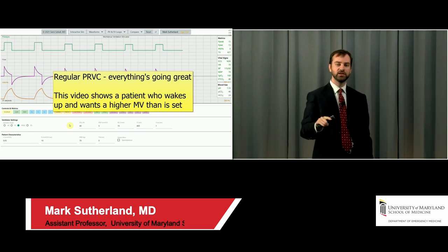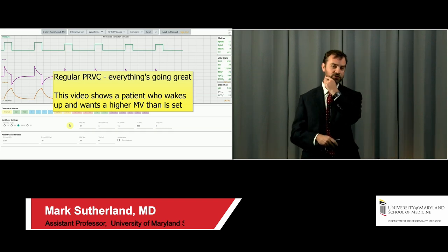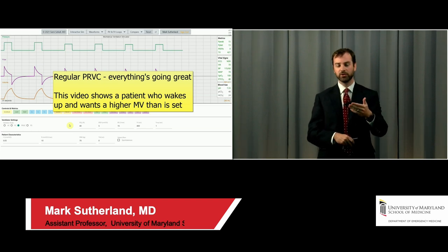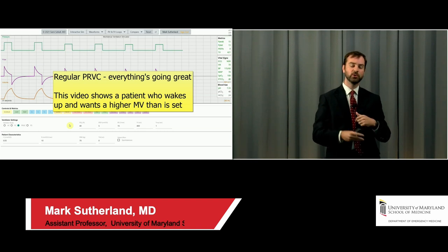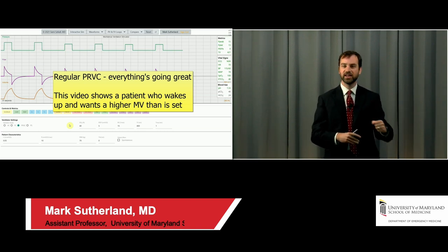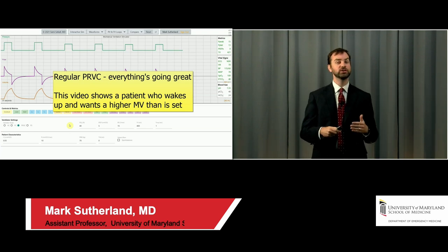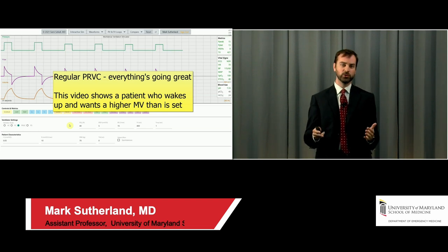At the beginning of the video, I've got the patient on PRVC. I don't know if you can see it, it's probably a little small on your screen, but Sammy's simulator has a box you can check at the bottom for whether the patient's breathing spontaneously or not. The video is going to start in a moment with the patient being completely sedated, paralyzed, not interacting with the ventilator. And over the course of the video, I'm going to wake the patient up and have them interact more and more with the ventilator.